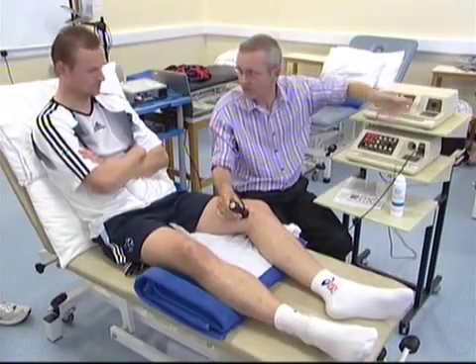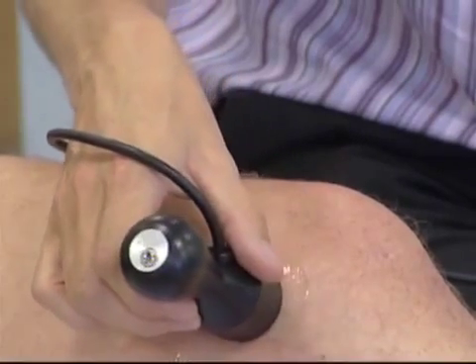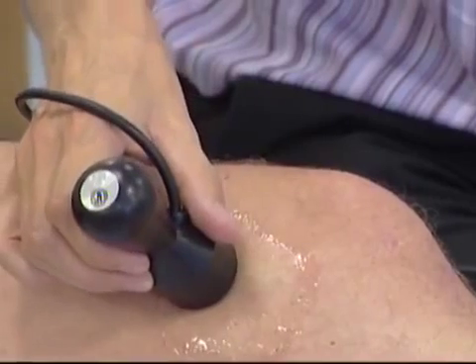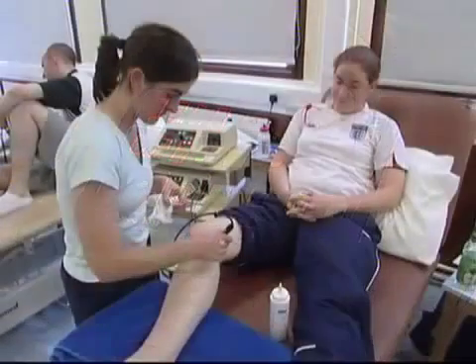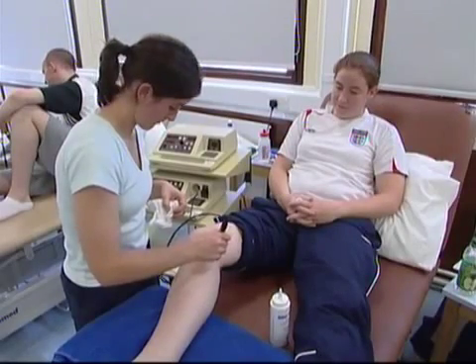Modern physiotherapy practice needs to be evidence-based, and electrotherapy is no exception. Research into electrotherapy is ongoing, and the evidence about physiology and effects presented in this film are subject to change as the research progresses. It is important to bear in mind that of the evidence that exists currently, the quality is variable, sometimes good, sometimes not so good, and the results are at times contradictory.